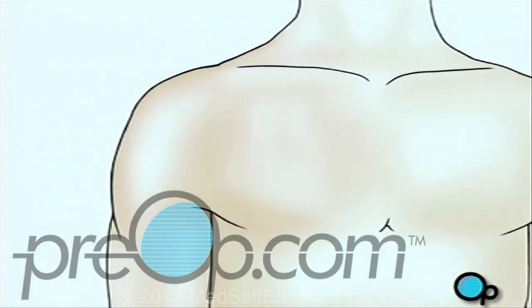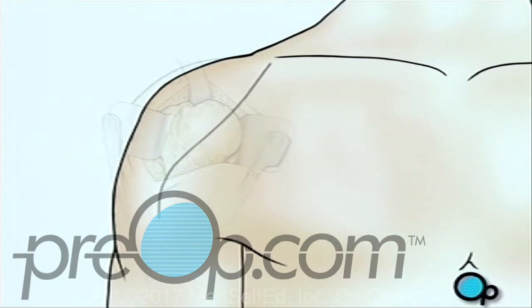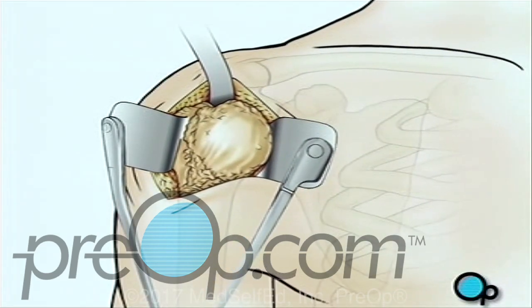When you are asleep, the surgical team will make an incision over the shoulder. The team will pull the skin aside to reveal the muscle tissue below. They'll then make another incision to reveal the shoulder joint.